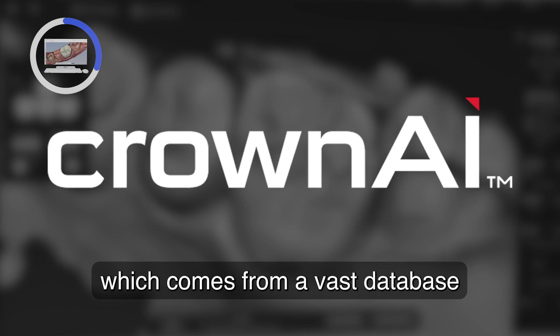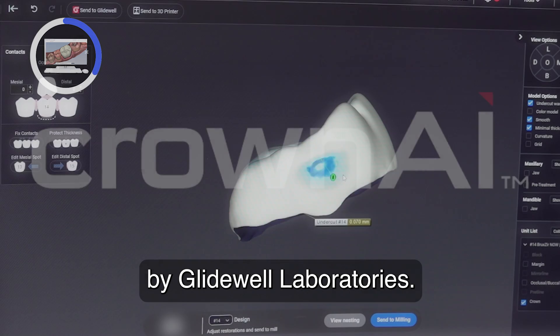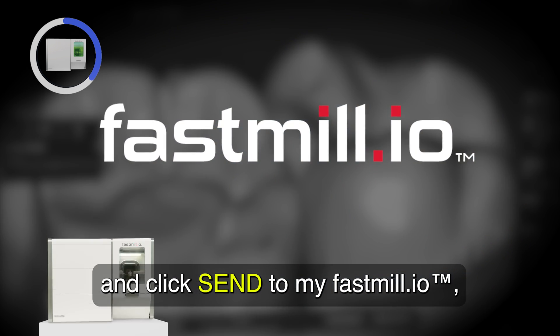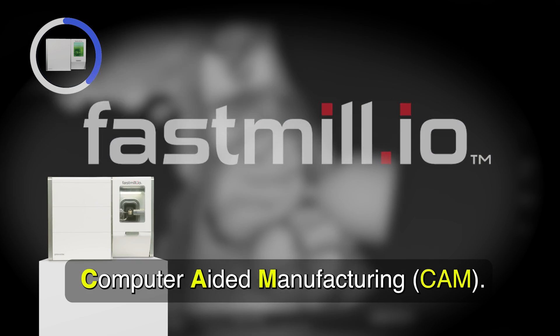This is called Crown AI, which comes from a vast database by Glidewell Laboratories. I check my contacts and click Send to my FastMill, also known as computer-aided manufacturing.